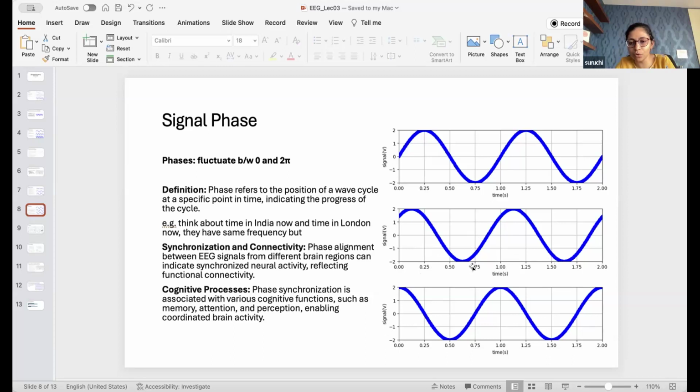In 1 second both of them have two peaks, one peak, one peak. Also, there's no difference in amplitude either. Remember, in the third one, if we see, in the 1 second there are two peaks, one at the start and one at the second.